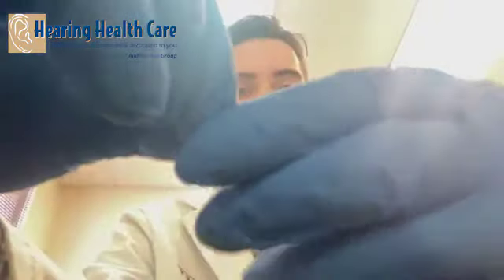For our Oticon MiniRite here, we're going to use a 312. These batteries are air-activated, so they have a tab on them. You're going to peel that tab off — now your battery is activating. One thing to know is that your battery will get the full potential of its use if you let it sit out for a minute or two after you pull that tab.